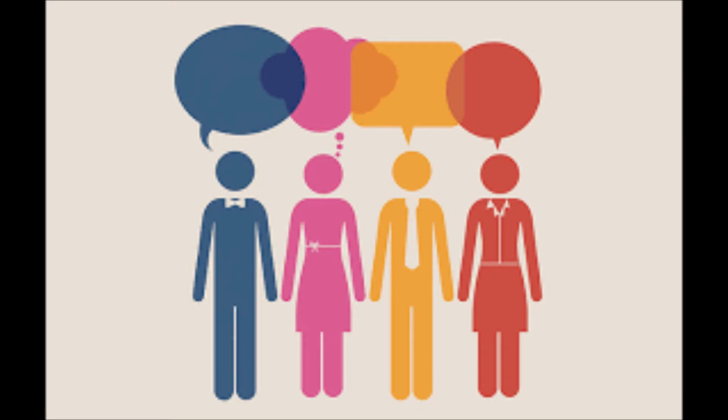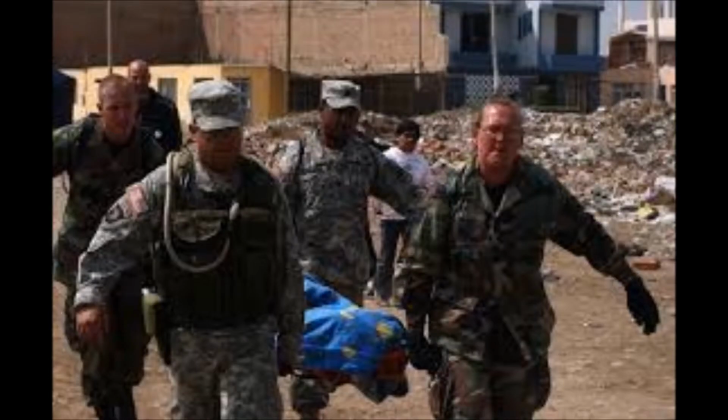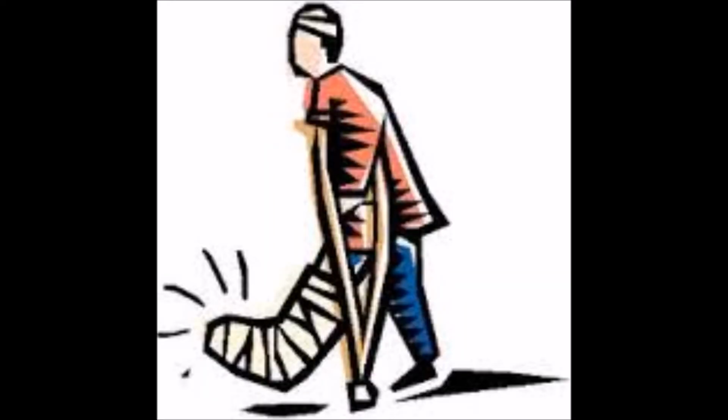Problem definition. In today's society, when natural disasters occur, medical personnel and the army will be deployed to help relieve the site. One of the most noticeable equipment that they bring along will be the stretcher. However, is our current modern-day stretcher really safe enough to transport casualties out of the site without any further injuries?